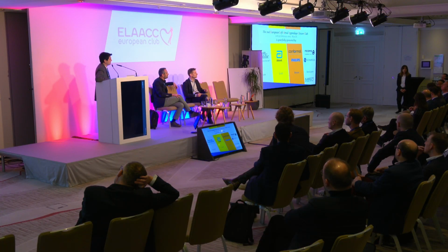As long as I have the ECG. This is a very good question, so thank you for that. I'm not saying that it's perfect. That's why I ask for the ECG, and then I assume the variability that I can find on the ECG. That's also one of the problems in a study. There are a lot of patients that we consider, for instance, medium risk, and actually maybe they are high risk, because the ECG that I got is from a sinus rhythm, from 3 months before the intervention. Then maybe on the day of the intervention, or even after, things change, and all the beats change completely. Yeah. Thank you.